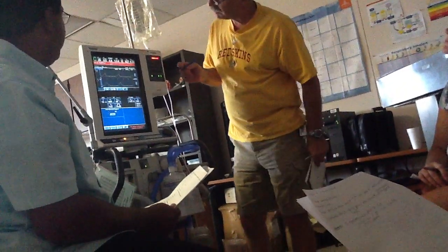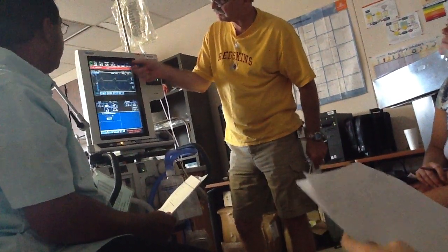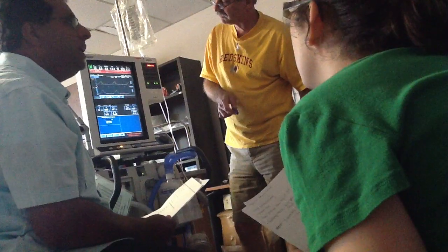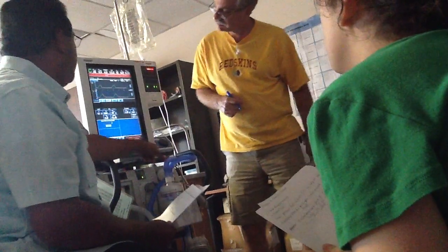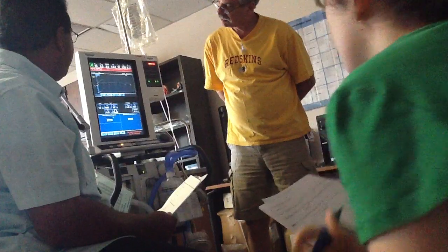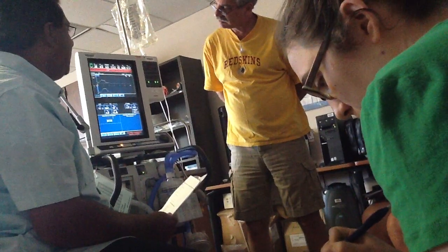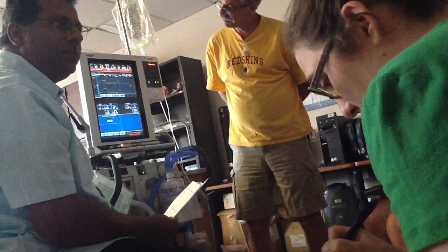This patient, not the paper. So PI should be this plus this. How do you get the PI? Plateau minus PEEP. Do the plateau again. Let's do a plateau check. 23 plateau. 23 minus 5, and 5 is your PEEP. So 18.